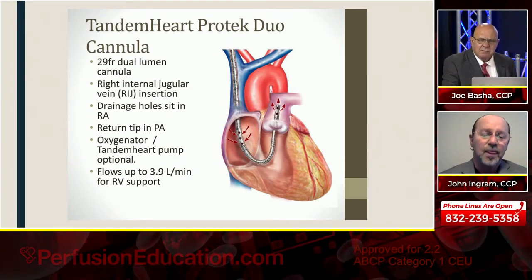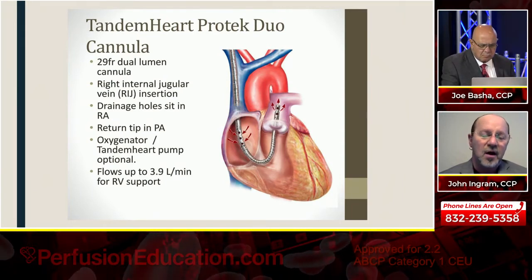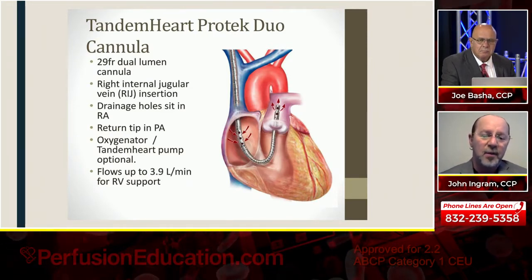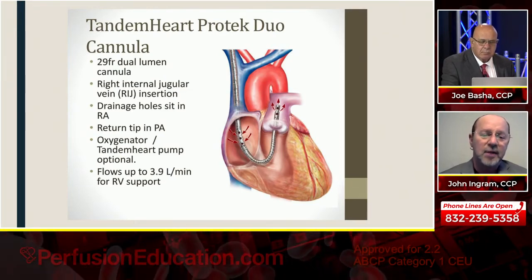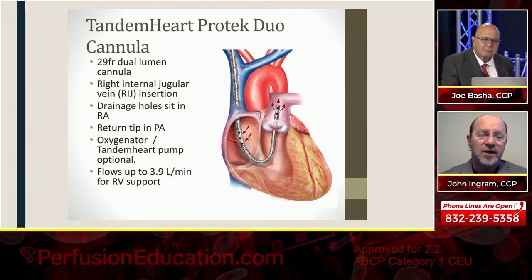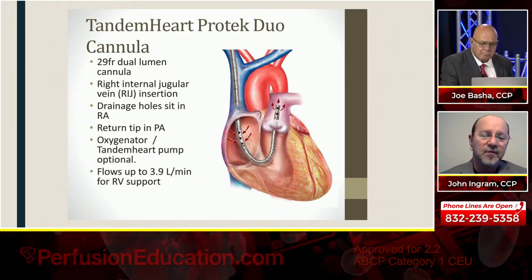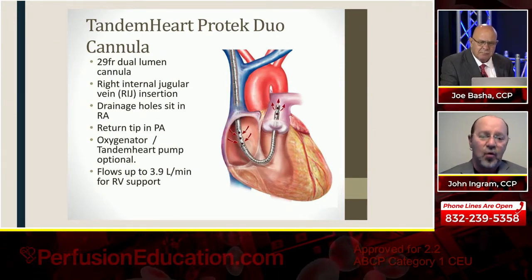No doubt. And tomorrow I'm going to talk about why that is important. The patient's cardiac output coming through the right atrium, if it is very high, which it can be in sepsis, you can have cardiac outputs of 10, 15 liters a minute, and you can only flow 3 or 4 liters. That's all you're capturing, that's all you're oxygenating. Yep, this is a pitfall sometimes of VV ECMO, that you can't flow more.